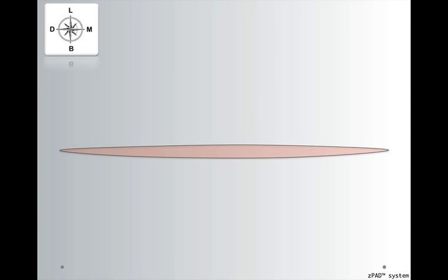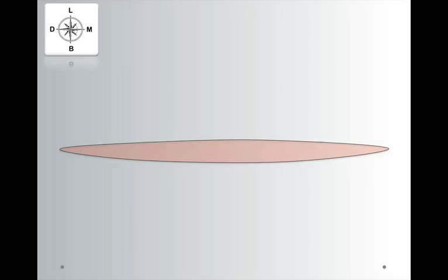And just to help you orient yourself, again, we have our surgical compass and that will allow you to see exactly what are the entry and exit points that I'm making. So the first entry point is on the mesio buccal. You'll pass your needle through the flap and you'll exit through the mesio lingual. You pass the needle through it and pass the thread through both edges of the flap.